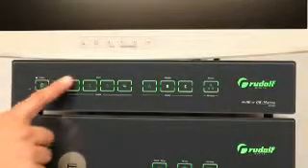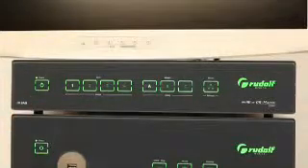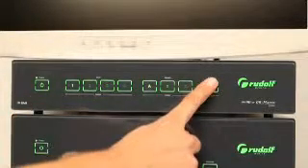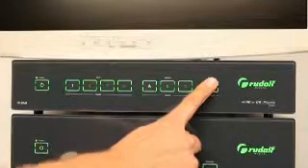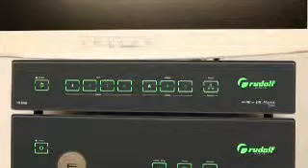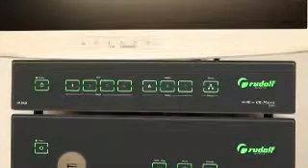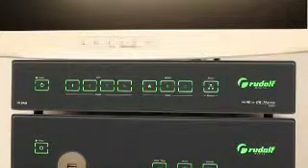How does that work? After selecting the image source to be transmitted, for example the endoscopy camera, and activating the network stream key, the selected video stream is available in the network and can be viewed and called up from various places in the hospital network, for example in the outpatient department, or in the auditorium, in conference rooms, and so on.